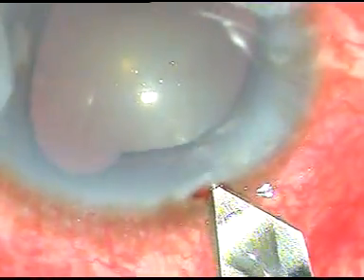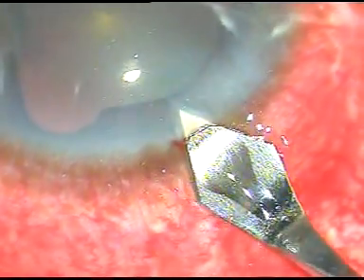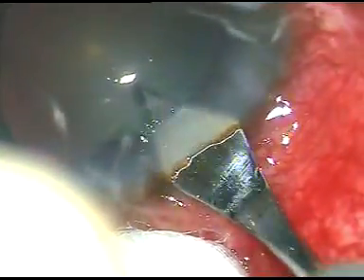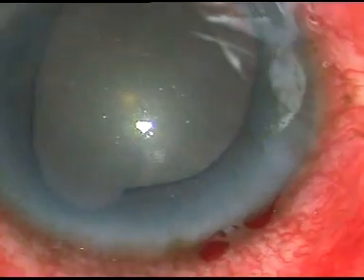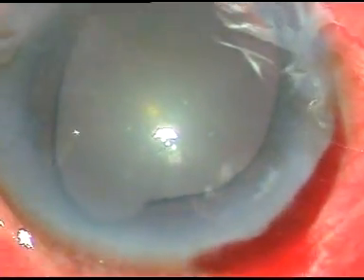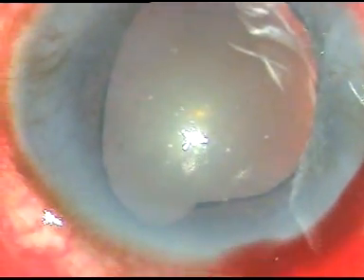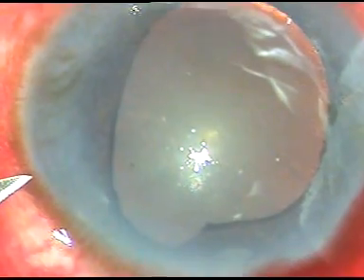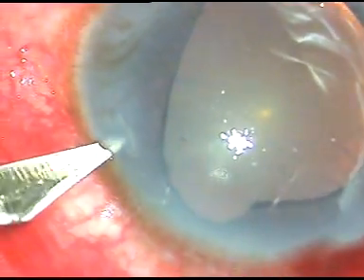YAG PI could not be done because of very shallow anterior chamber, so I have planned clear lens extraction with IOL implantation in this case. Let us see the surgical steps. By this time the main incision 2.8 mm has been made, and this is a side port incision on the left side of the main incision.